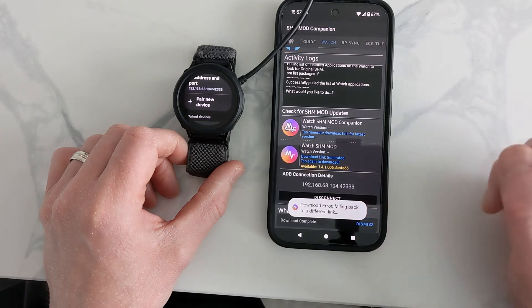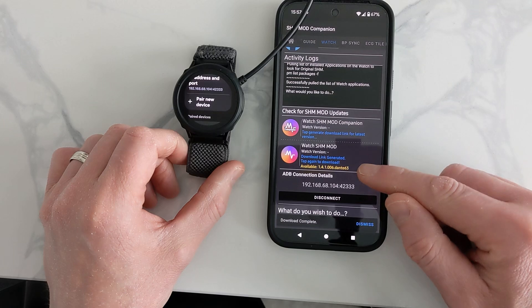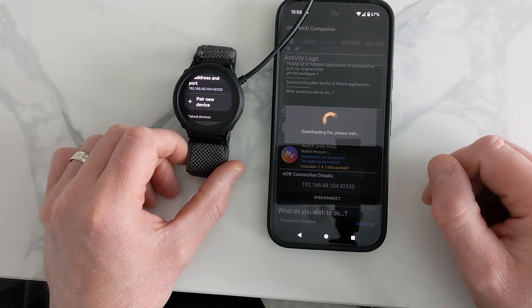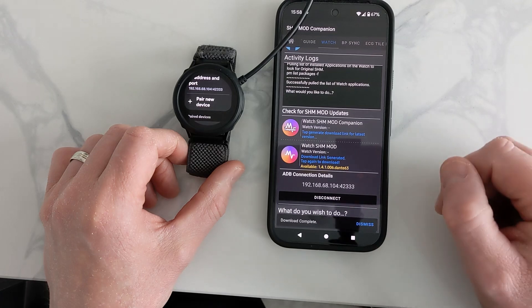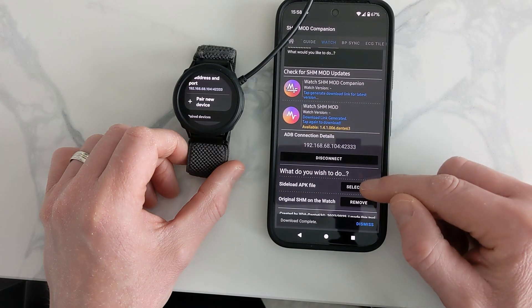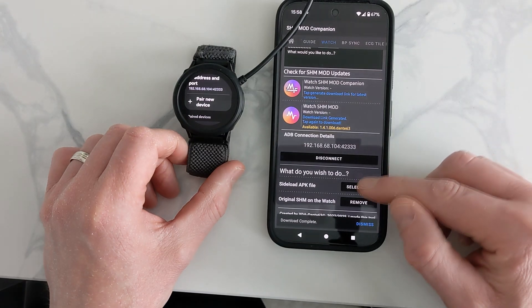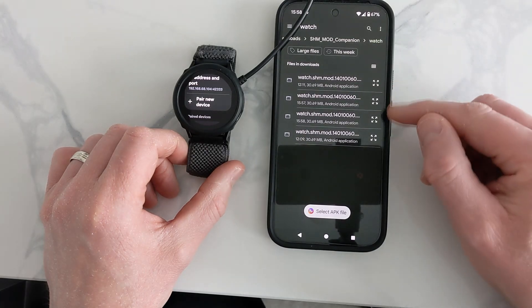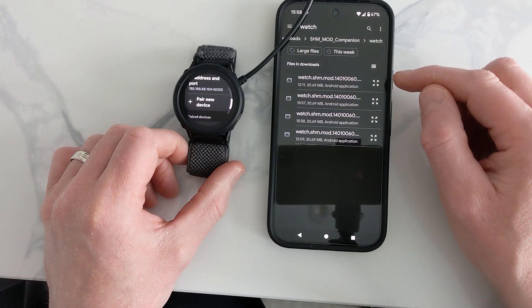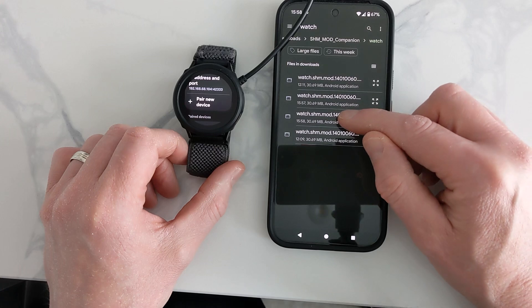I'm getting an error here — this could be because the app was only just updated while I was recording. If you get this error too, just download it again. Even though it shows an error, when you download it, your phone puts the file into a folder called the SHM folder. Go to select and you can see it's downloaded a few times — the timestamp shows 15:58 so it has actually downloaded. Just press it.